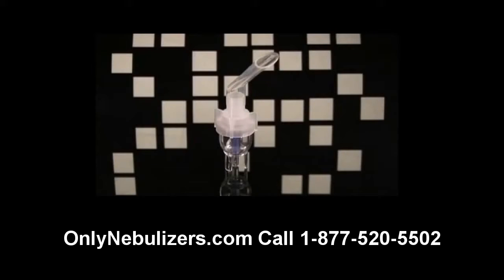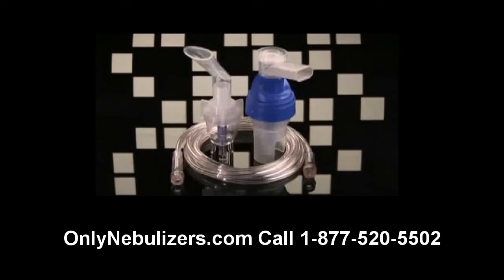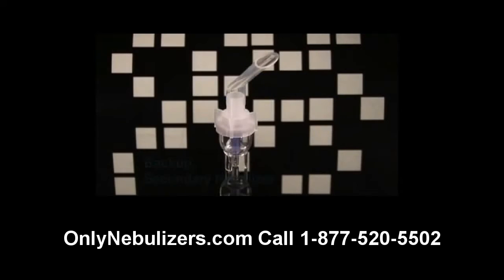You received a disposable nebulizer with your DeVilbiss Traveler compressor. Please note that you may have also received a reusable nebulizer with your unit. Refer to the nebulizer packaging to determine the type of nebulizer. If you have received a reusable nebulizer, please use that as your primary nebulizer. The disposable nebulizer should be used as your backup nebulizer should you lose or damage your reusable nebulizer.